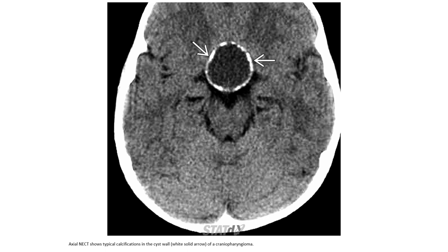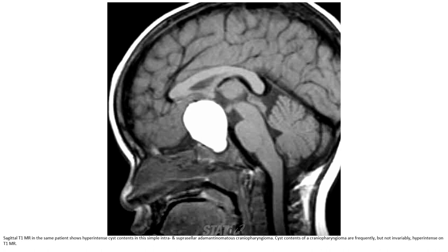This is the non-enhanced CT showing typical calcification in the cyst of the craniopharyngioma. T1 MRI in the same patient shows hyperintense content in the cyst of an intra- and suprasellar adamantinomatous craniopharyngioma. Cyst contents are frequently, but not invariably, hyperintense on T1 MRI.